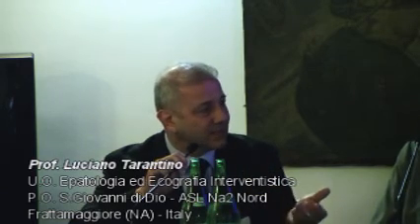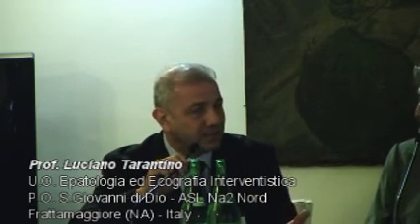Not always say, okay, make this CT, because CEUS can give you the final diagnosis. But to me, the main role of CEUS is integrating, and it is really useful in performing interventional procedures and even surgery. So we use CEUS in operation, in open operation too.